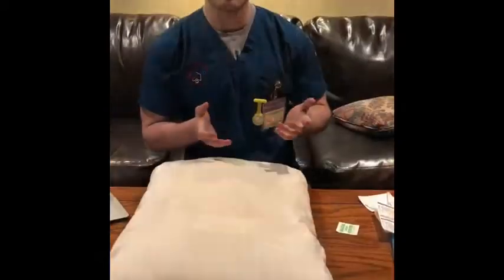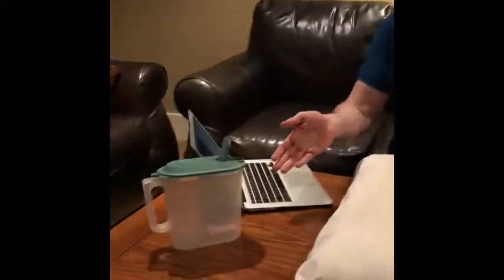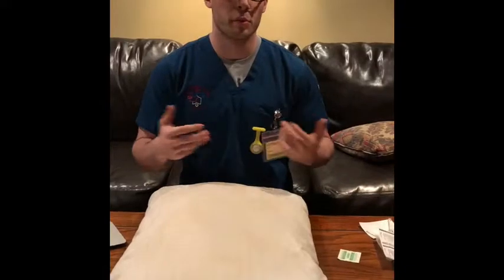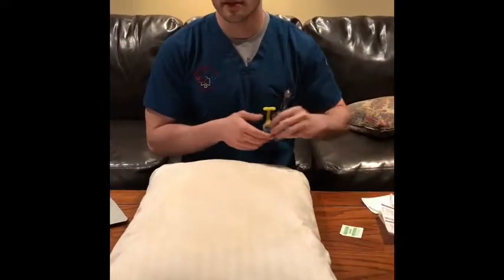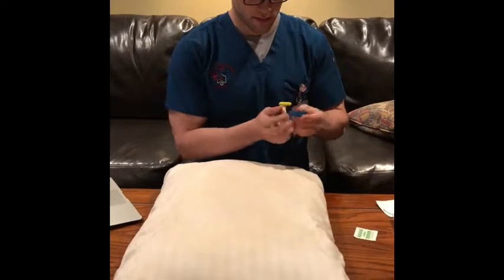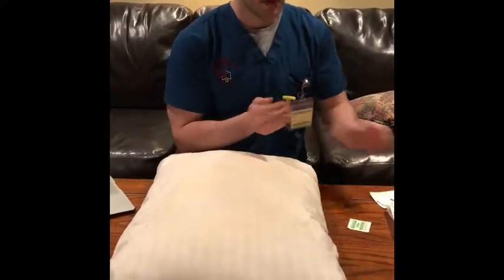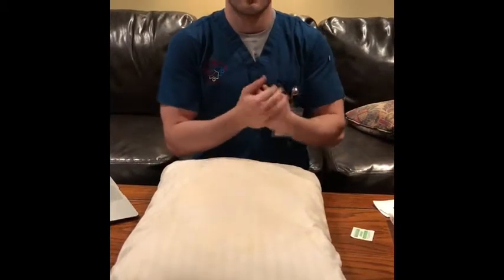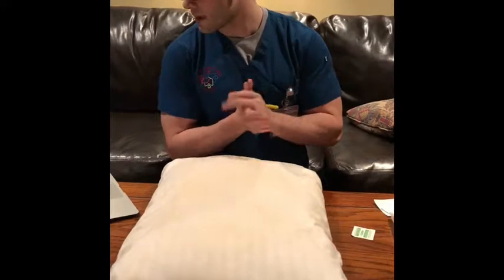So now that we've assembled the needles and the medication and disposed of the soiled supplies in the proper sharps bin, we'll actually prepare for the administration of the needles. So we'll start with some hand hygiene. And then after that, we'll put on some gloves just before the administration.